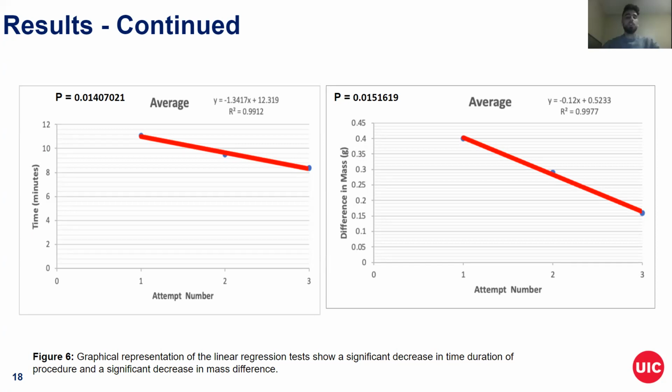To sum up, both linear regression tests verified our goal that training sessions on our model decrease procedure time and increase mass removal accuracy.